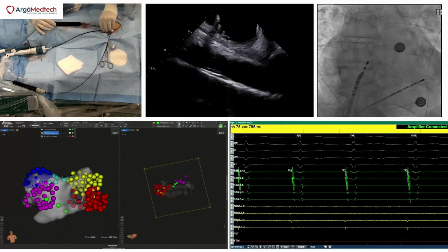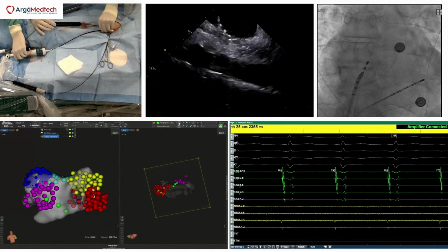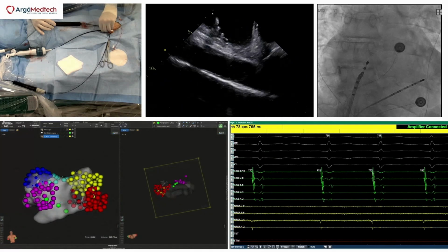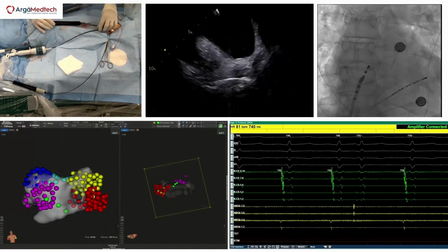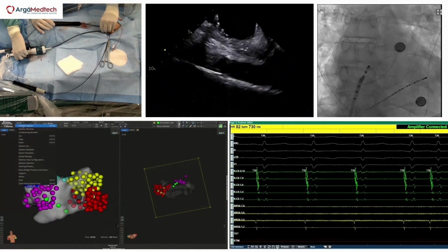Just wait for our arrhythmia guys to switch between visualization. Again, not a seamless integration is the best. Tony, I think we have a good contact. Yep. And for the bipolar business, it's good that we are almost linear or parallel to the tissue. Okay, now I'm waiting for the catheter visualization. I need 1, 2.